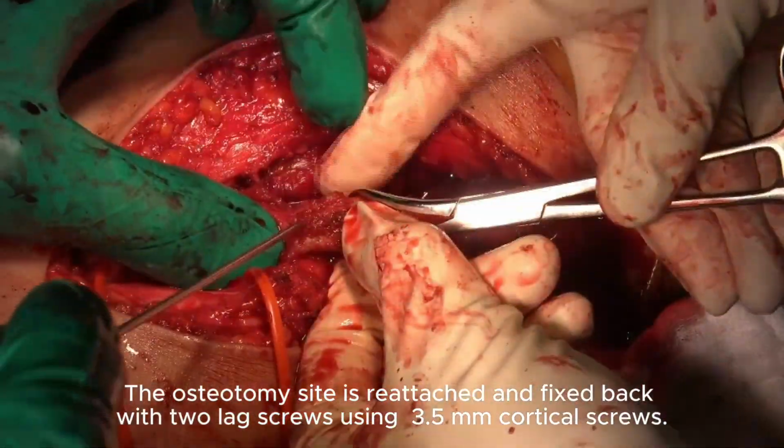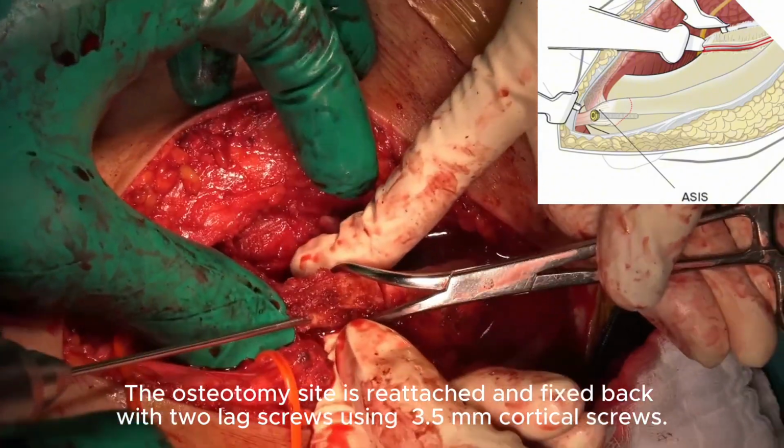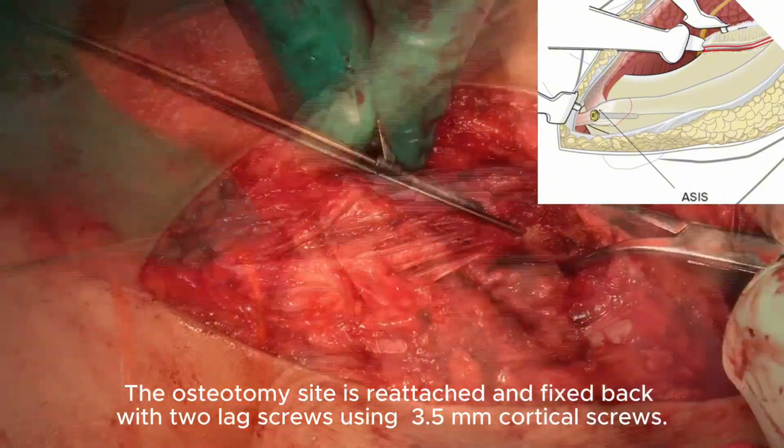The osteotomy site is reattached and fixed back with two lag screws using 3.5 millimeter cortical screws.